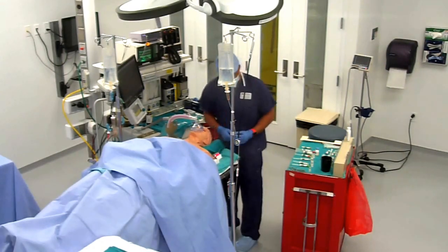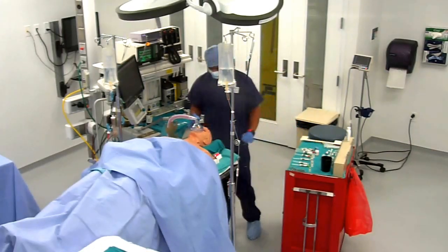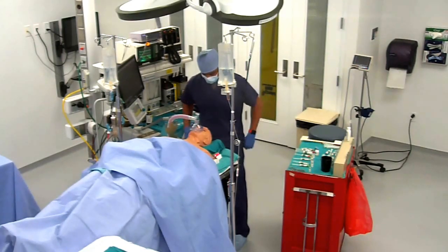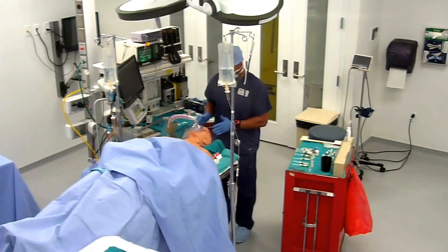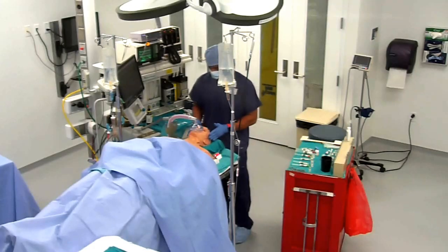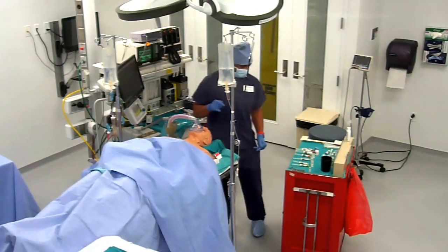All right, Katie, how do you feel? I feel better. You feel better? Yeah? Take some deep breaths for me. Nice, big deep breaths. Good. I'm gonna assess her level of consciousness, kind of see where that midazolam fentanyl combination has put her. You ready for your surgery? Are you from the Springfield area? I'm just trying to see how sleepy she is to assess if I need propofol. From Kansas City. Oh, Kansas City. I'm a Royals fan. All right, Royals fan.